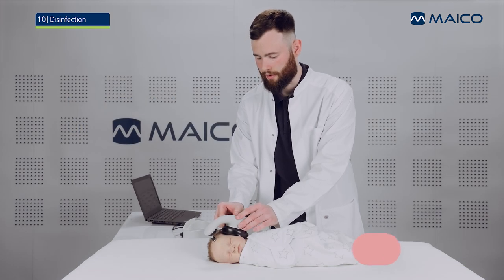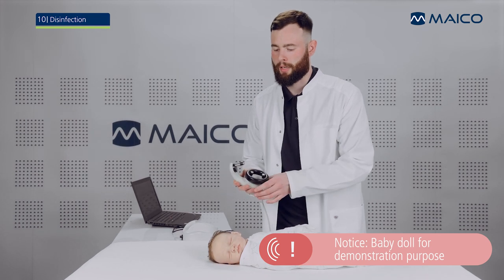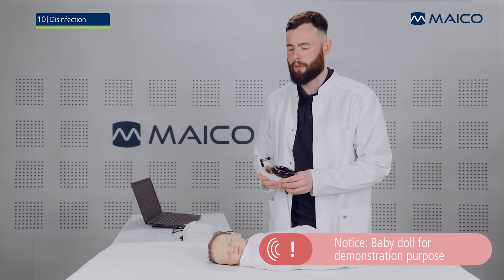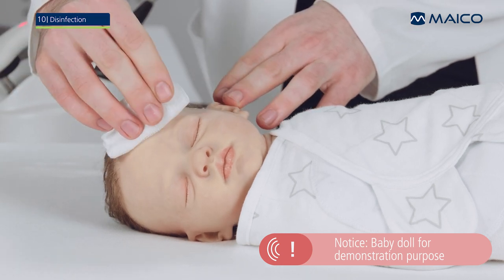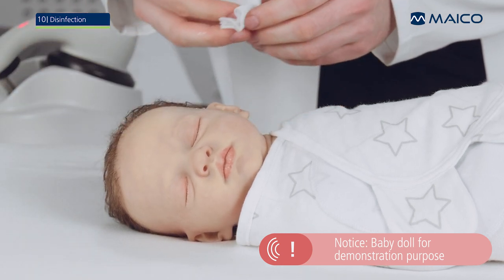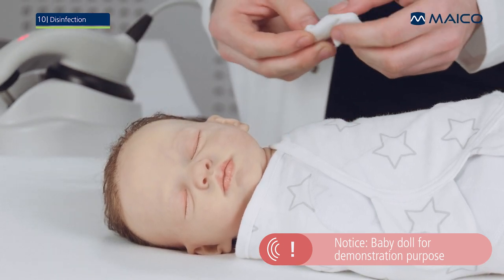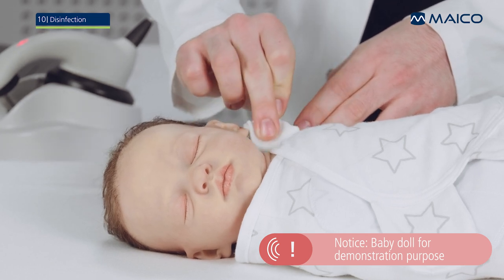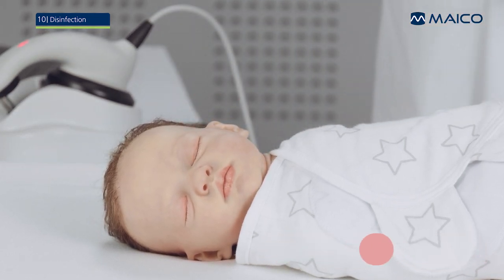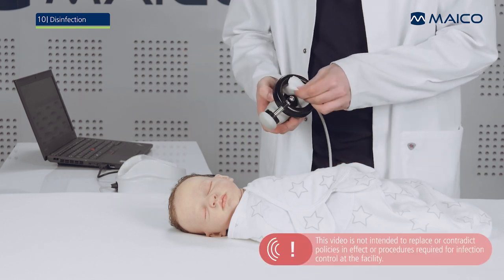After the test on the first ear is completed, remove the MB-11 Barafone and prepare the baby's other ear as described earlier. When testing is complete, wipe the electrode gel from the baby's skin. Then clean and disinfect the Barafone as described in the operation manual before use on the next baby.